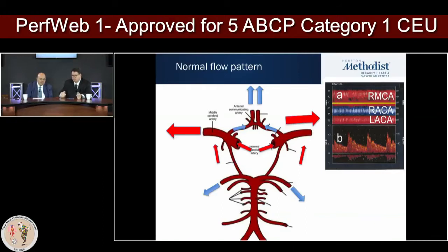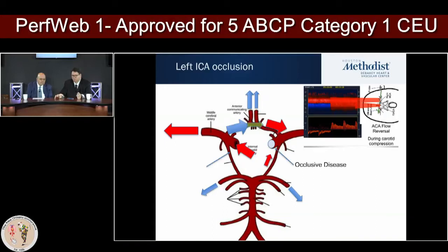And this is the other information I wanted to show you, to make it nice and clear to understand this blood flow pattern inside the middle cerebral artery and the ACA. Again, just one more time, these are the two carotids coming up, and these are the two MCAs, with two red and two blue signals. Let's block the carotid. The moment you block the carotid, you're going to have a reverse flow coming from the other side, and this is how you can reverse the flow in the ACA.